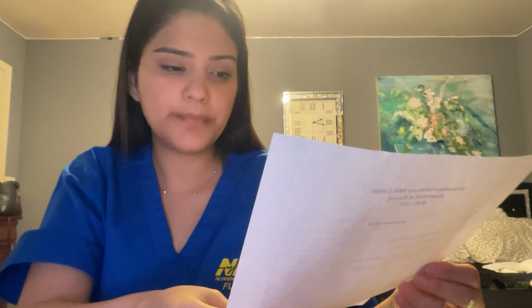Okay, so for the intradermal, which is going to be my tuberculin, I have the group 3. So for the tuberculin, they want 0.1 milliliters of it. I already prepared that in my tuberculin syringe. It's already prepared. I drew it up.